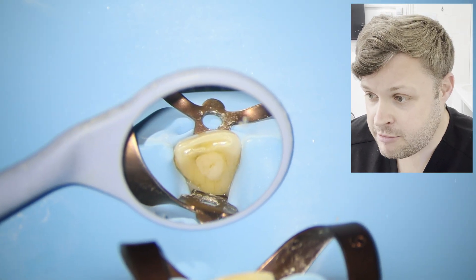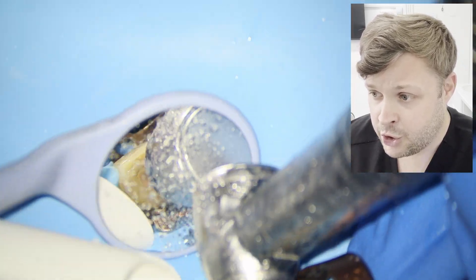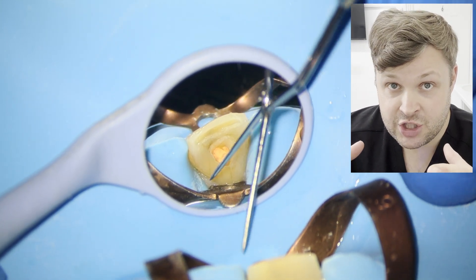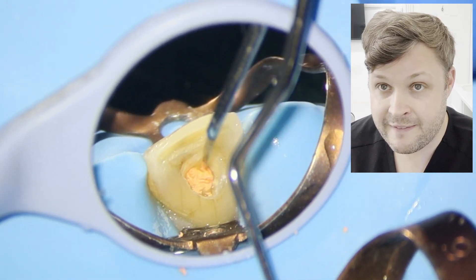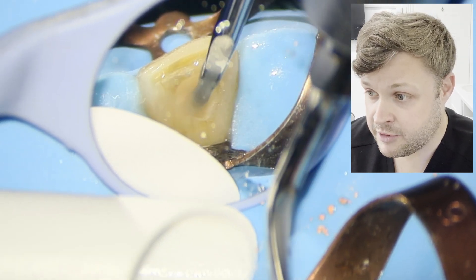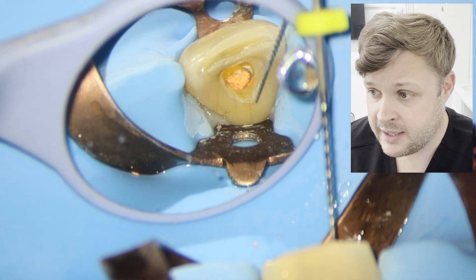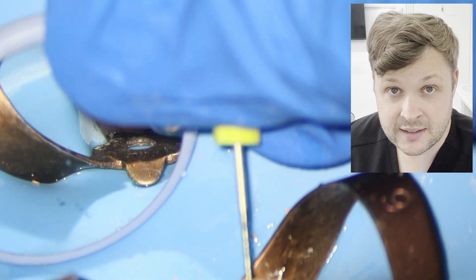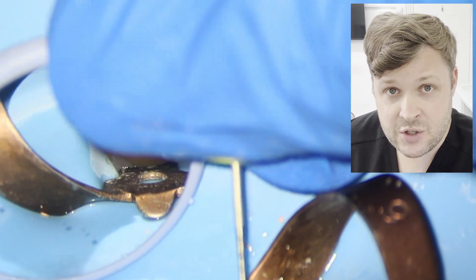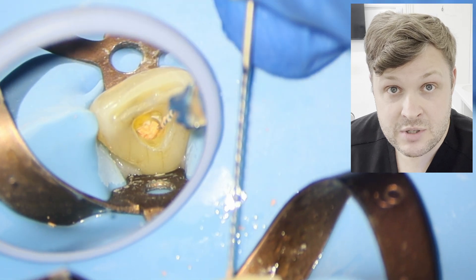So this is a re-route treatment on an upper central, and what I'm doing is just removing the filling material to open up and see where the GP is. When we look at the GP it looks nice, well compacted and quite fresh, which I feel is a pretty good sign for prognosis. I'm just simply using H files — I used to use rotary files to remove the GP, but now I just use H files.